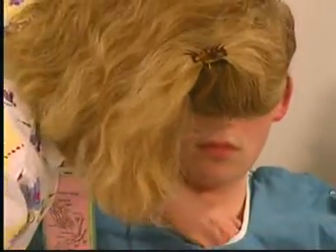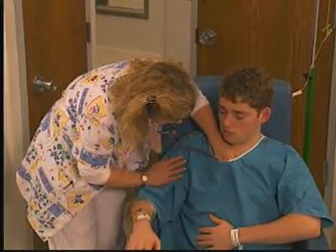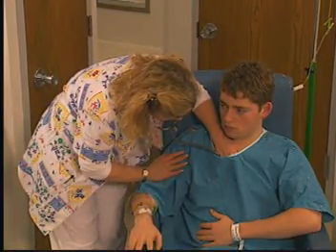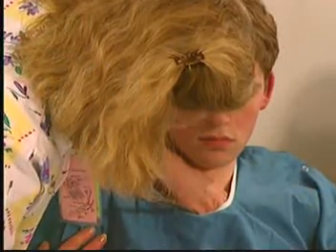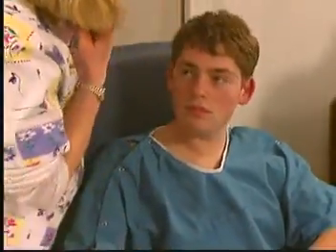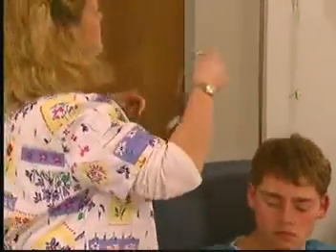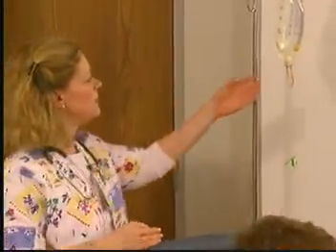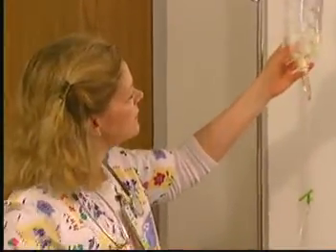Planned assessments should take place every 1 to 2 hours. Include in your observations Mr. Schwartz's vital signs, fluid status, and intake and output. All right. Then perform a systematic assessment of the IV infusion. Looks like your IV fluids may be slowing down just a bit.